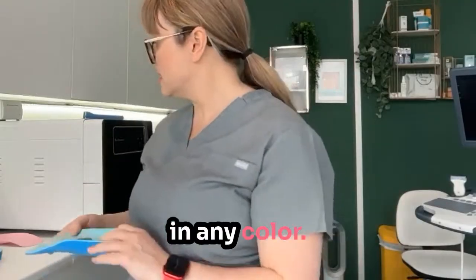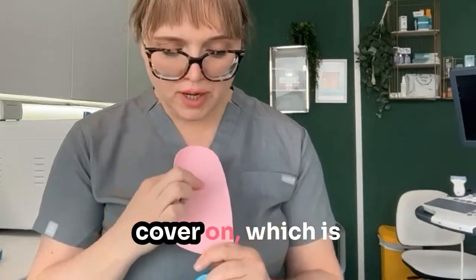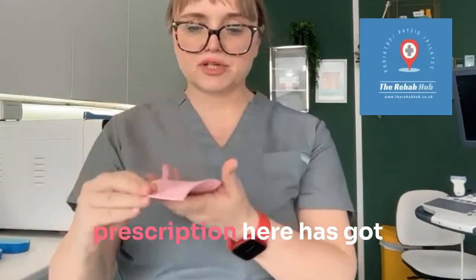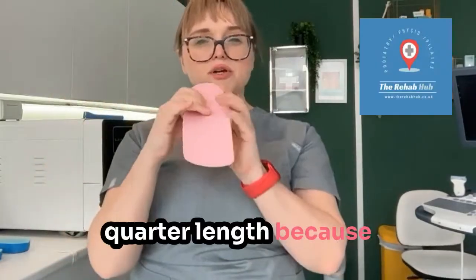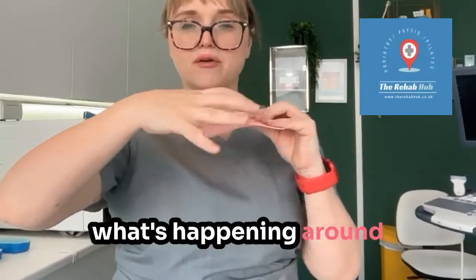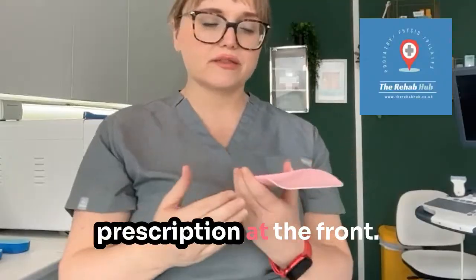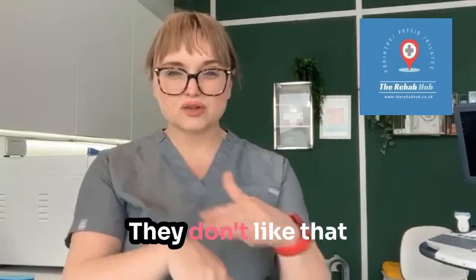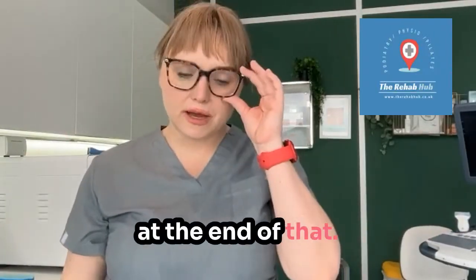We can do these in any colour. Here, this is what it looks like without the top cover on, which is absolutely fine as well. You don't necessarily need that top cover. This particular prescription here has got a medial arch support, it's got a deep heel cup, and it's only three-quarter length because we only need the prescription at that level. We only need to control what's happening around the heel and into the arch. There's no point in having all that bulk in a shoe if there's no prescription at the front. Some people like a full length because they say it just feels weird. They don't like that sensation in their foot. There just would be no prescription at the end of that.